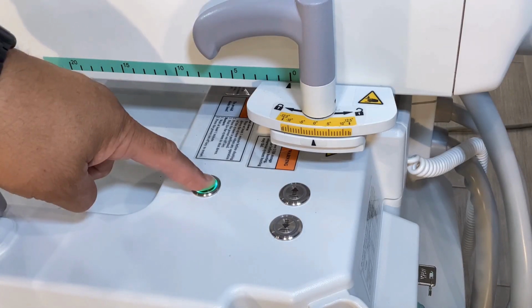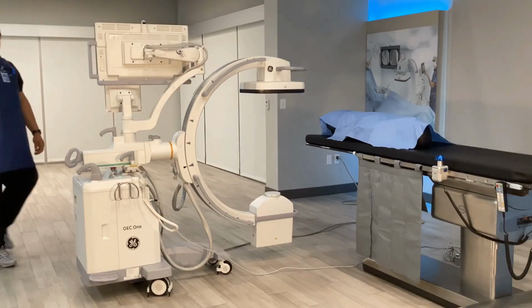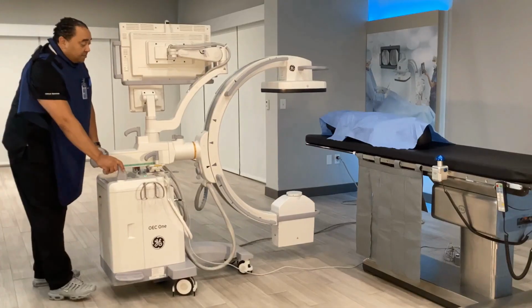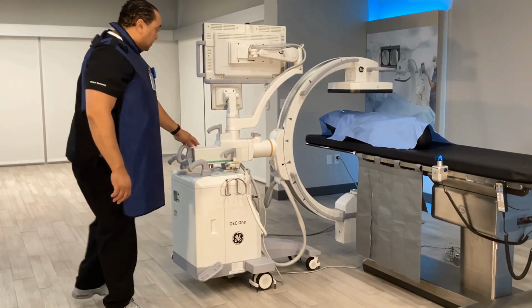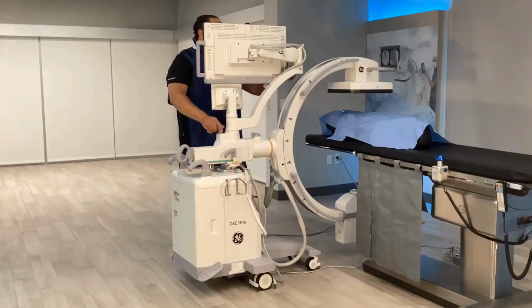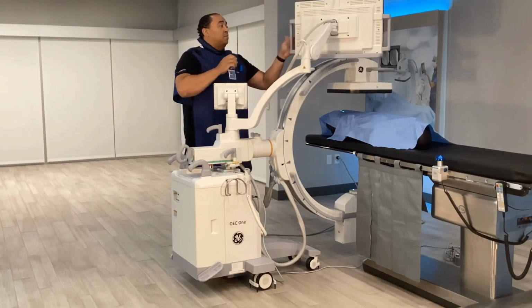Power on the system by holding down the silver button until it blinks green. Move the system into case start position and lock the brake. Move the monitor arm to access the screen to enter patient information.